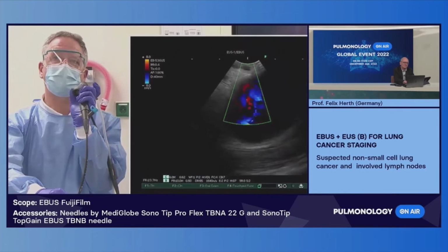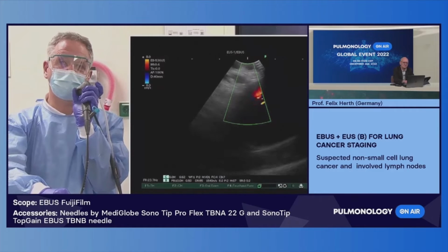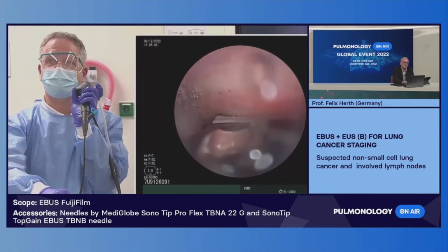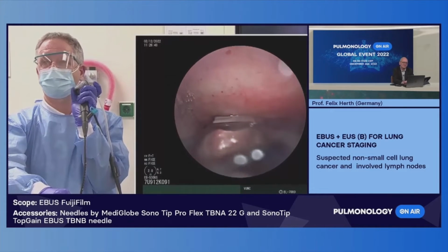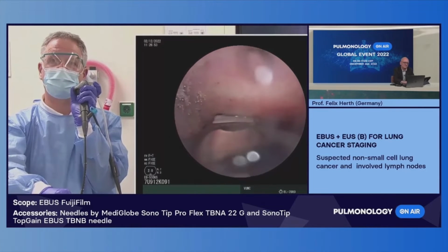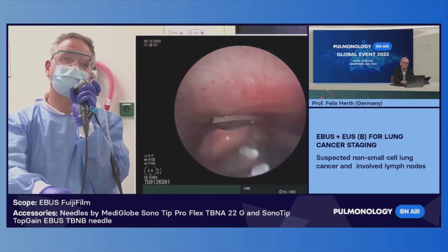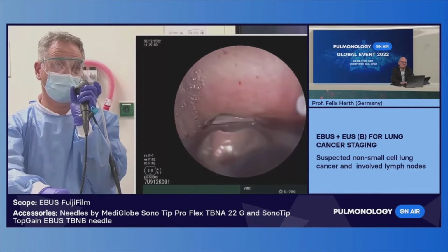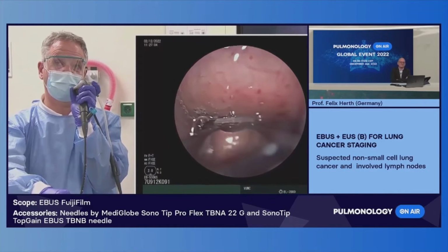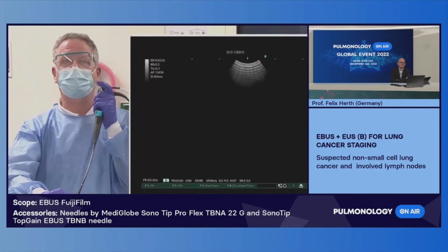When I just slide the endoscope down, we can see a very tiny lymph node, paratracheal to the left, under the aorta, short axis estimated to be 3 to 5 millimeters, vague borders, maybe some fatty sign in it. This is station 4L, contralateral, and it seems normal to me, not enlarged. Ultrasound characteristics compatible with a benign lymph node.